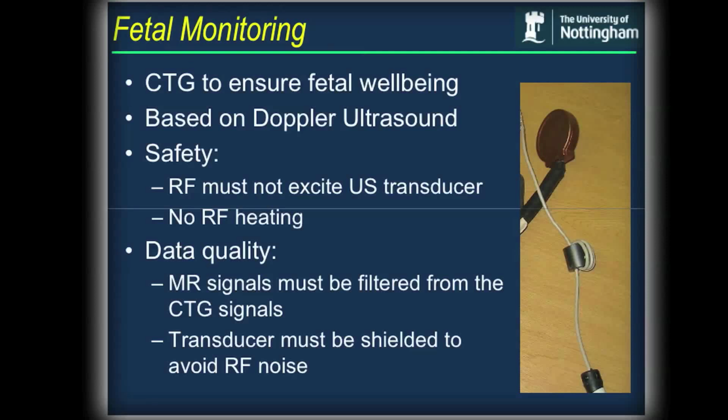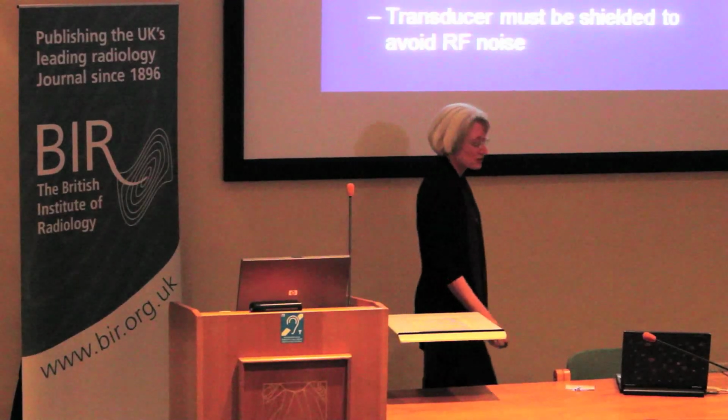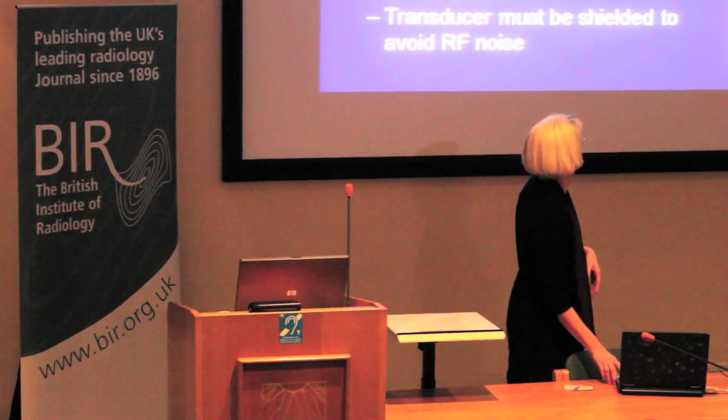So we need to make sure there's no RF excitation to the ultrasound. We don't get ultrasound at RF frequencies either, and no RF heating. And then you need to do quite a lot of work to filter it. But anyhow, it is possible to do it, and I believe somebody's using it for fetal behavioural studies at the moment.